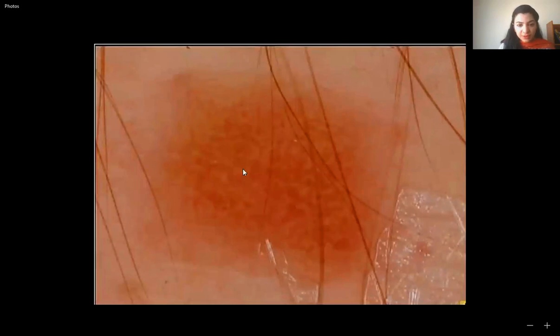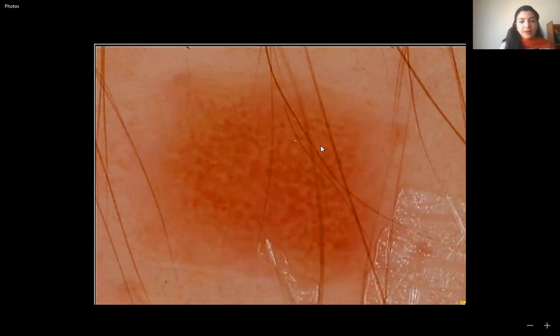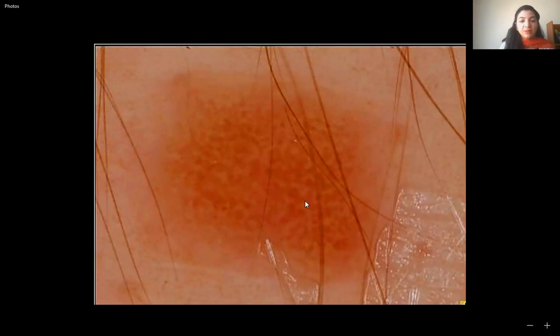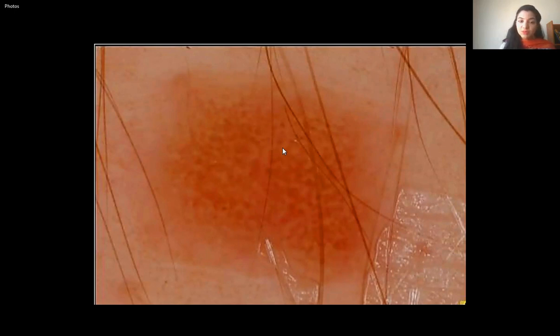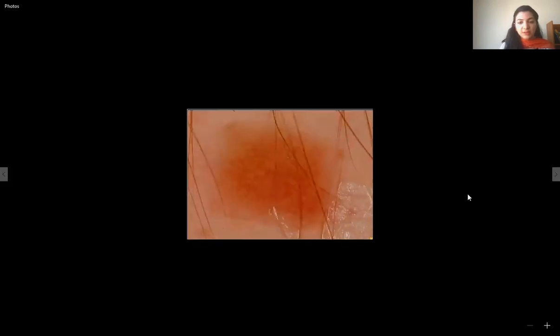As you can see, the whole lesion is light brown with multiple shapes of brown color. Hypopigmented areas appear to divide these brown structures, making different shapes while they are completely or incompletely connected to each other. These hypopigmented lines make up a network that is the reverse of the typical network — where brown lines enclose depigmented areas, here the depigmented areas enclose the brown structures. This is called the reverse network or negative network, and it is one of the diagnostic features of melanoma. This one is a melanoma.